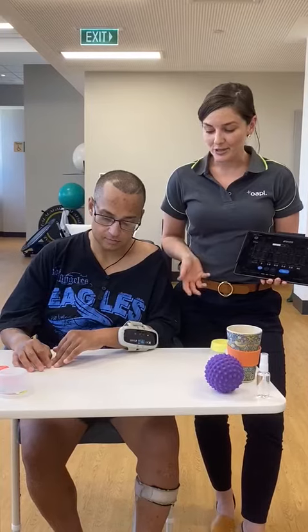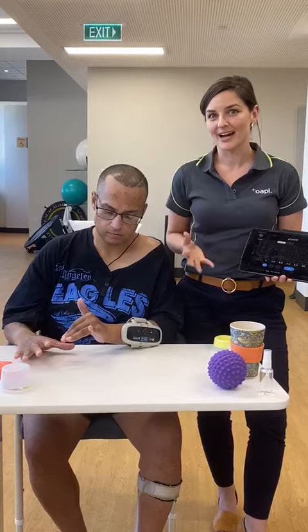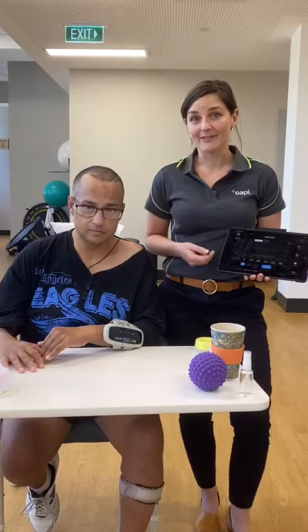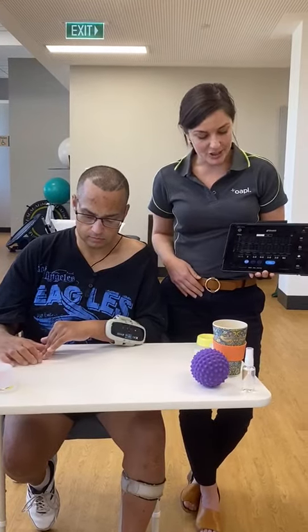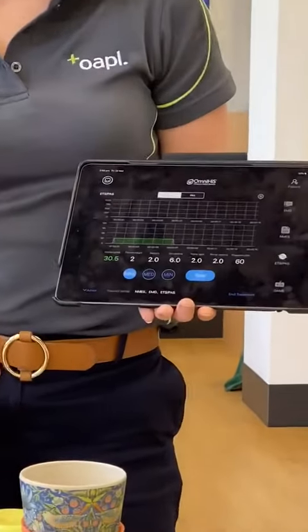When Junior's not using the device, he's not able to have a really open, extended hand and wrist. It's also connected to the iPad over here via Bluetooth. There's an app for the Omni High 5, and you can see that each stimulation is shown on the graph on the iPad.